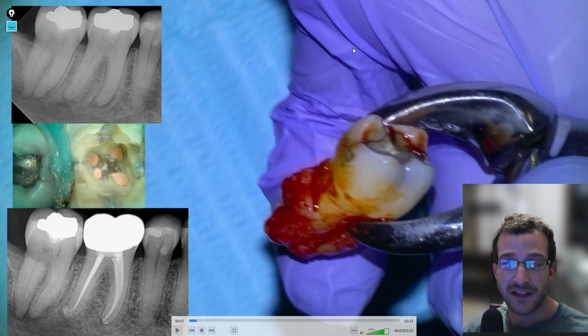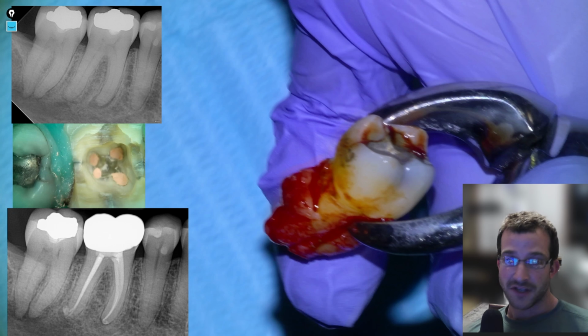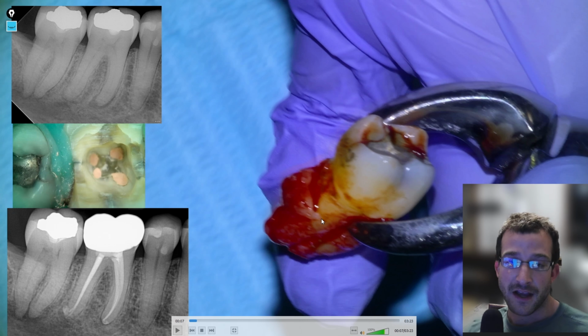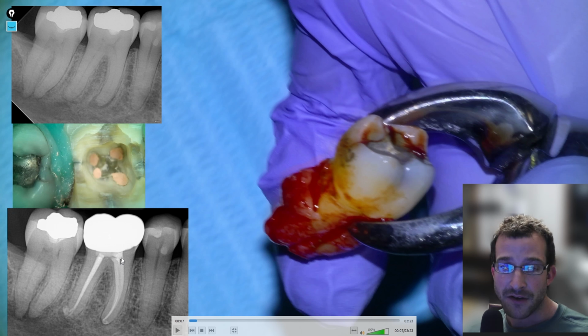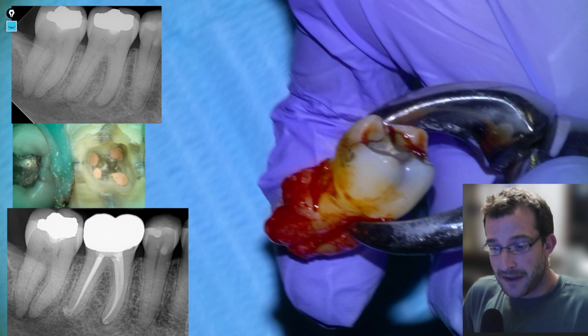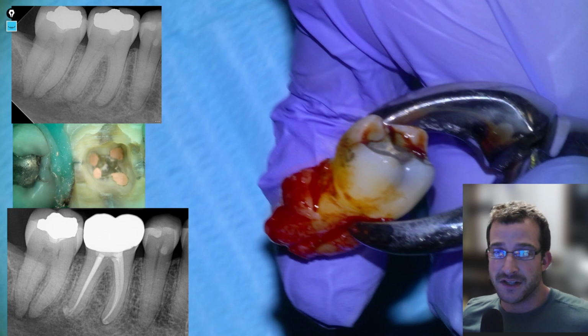We can see a lesion on the mesial root of the 4-6 there. Because it had the crack line and the amalgam, we said that we can do an endo and a crown happily, but the prognosis is kind of questionable with cracked teeth. Fortunately, we ended up with a healing outcome and no symptoms on this tooth, but the patient came back a few months later and said that I still have pain when I bite down in that quadrant.